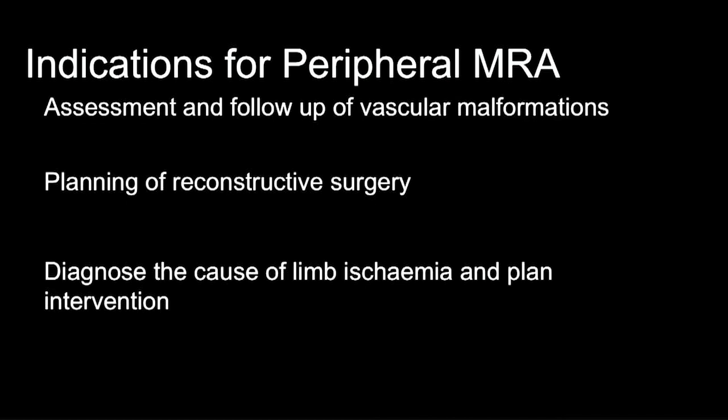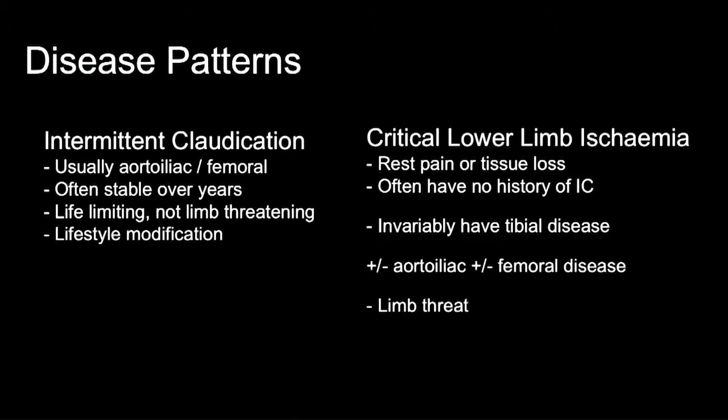flap survives post-surgery. And then critically, to diagnose the cause of limb ischemia and plan the intervention, because we don't take pictures just for the sake of taking pictures. We take them so that we can work out what's wrong and actually do something about it, and that's what I'm interested in, planning the interventions.